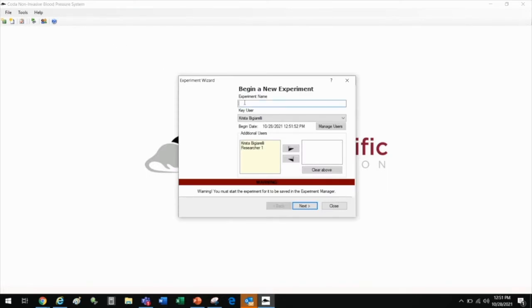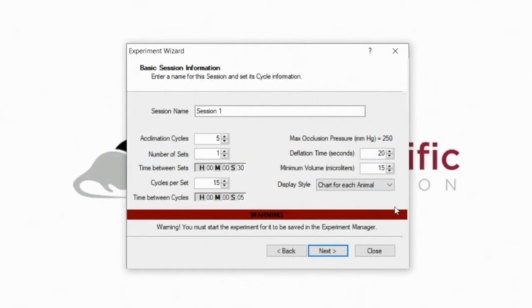For this demonstration, we will create a new experimental protocol. This can be a protocol number or an experiment name. The CODA software will allow you to save your settings across each session of an experiment.